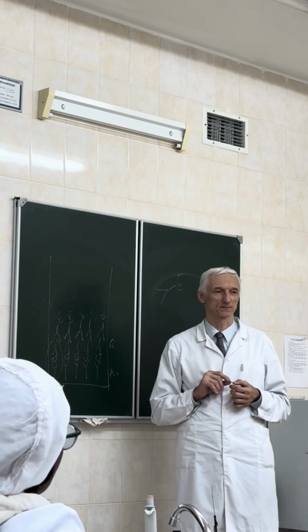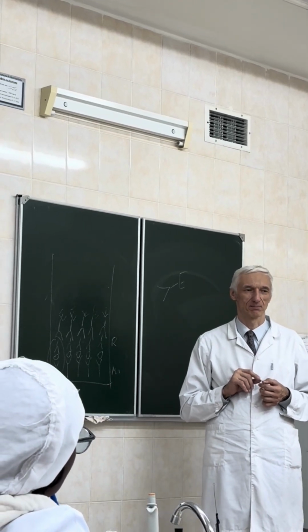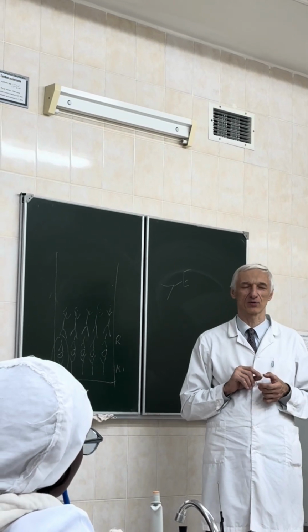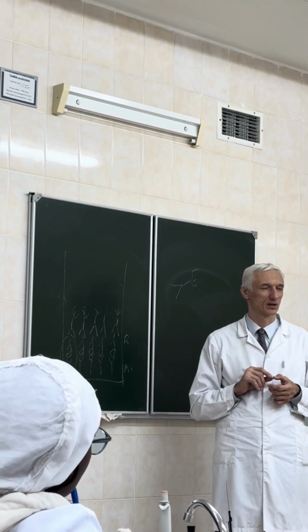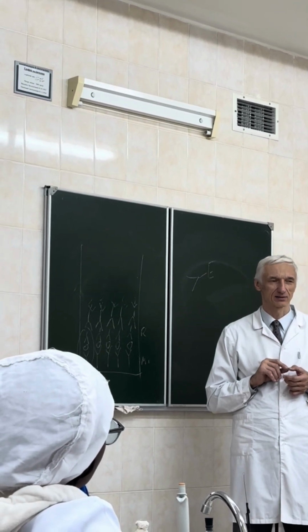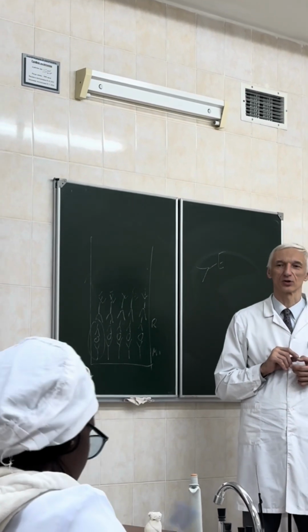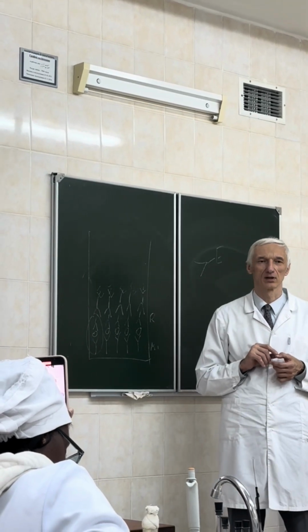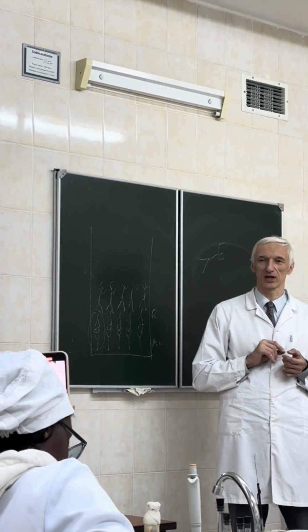What is the process? Someone should pronounce the keyword. Every antibody is produced by immunization. So that's why we have to immunize whom with what? Anti-rabbit antibody should be obtained.